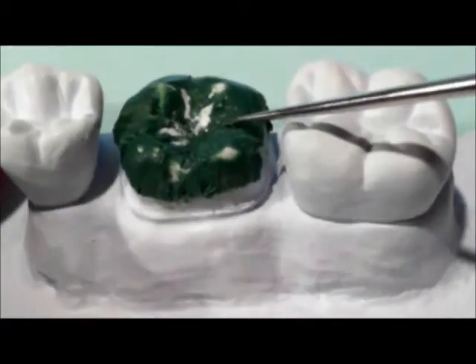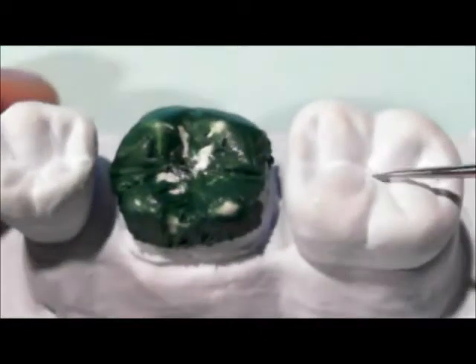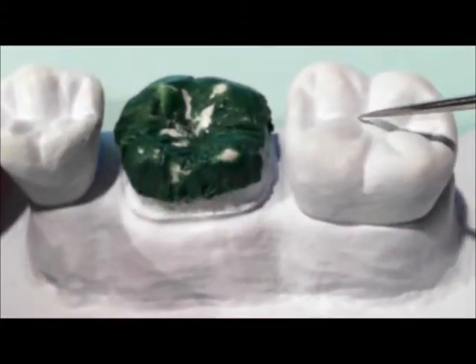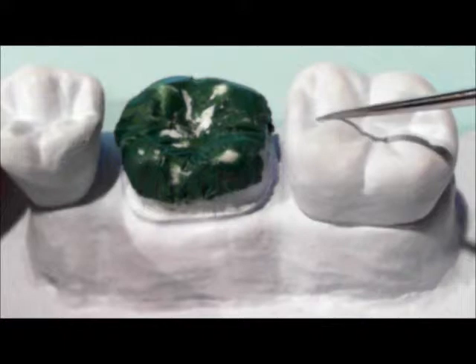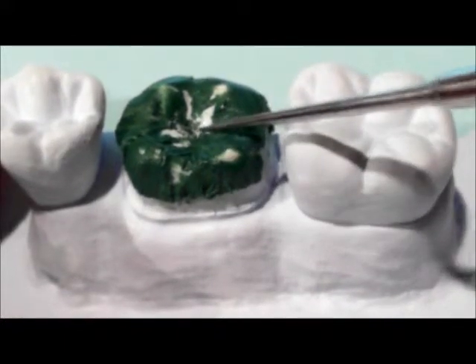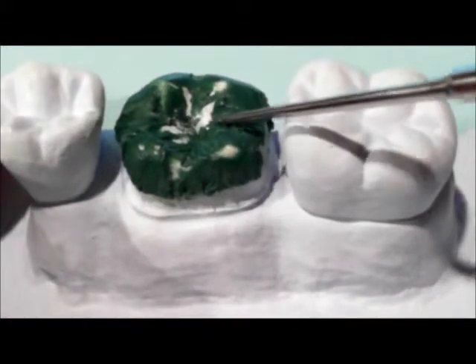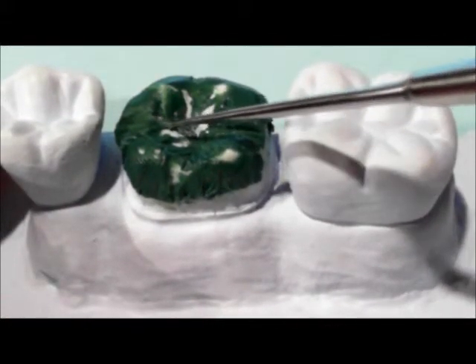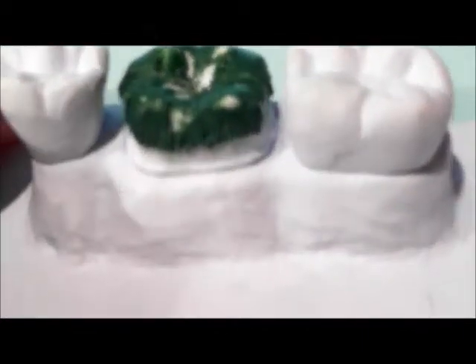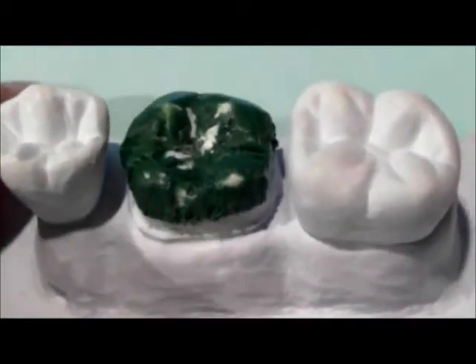shallow. Okay, so if you look at the second molar here, it's got little pits in it. Okay, so we're gonna make the central pit of this first molar. It'll be a little easier to make. Okay, so we just take some of it out. That'll look all impressive, but just take some of it out.